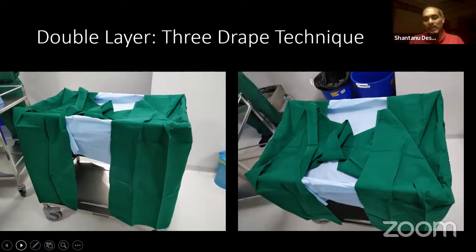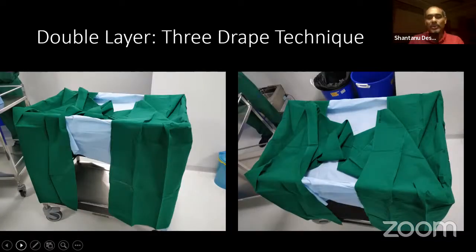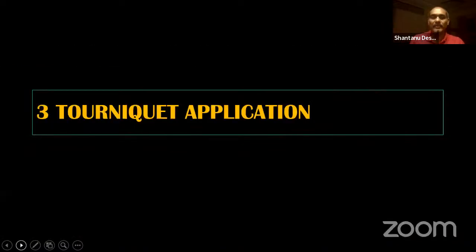This is a second way to drape the trolleys. Initially you have seen we used a single drape to cover all 4 corners. This one is actually a better technique, but the number of drapes required is more. Both ends you can cover with the long drapes. The initial drape using a single cover covers only the middle third of the trolley. If you watch the second technique, you can cover almost up to the wheels of the trolley. And once you have put these two side drapes, you can put the third one on the top. This way you can cover both sides, front and back, which is facing the surgical table, as well as the sides, because that's where the contamination can happen.